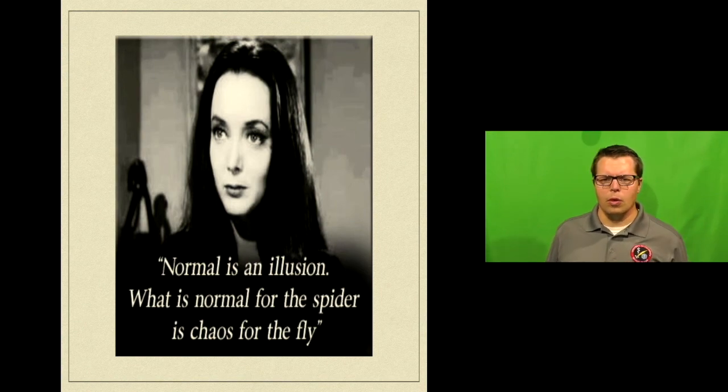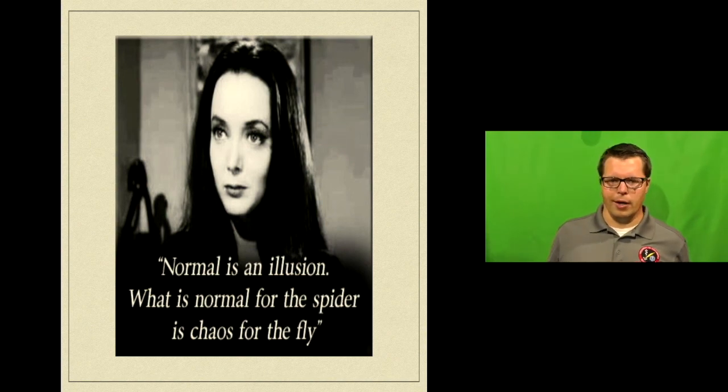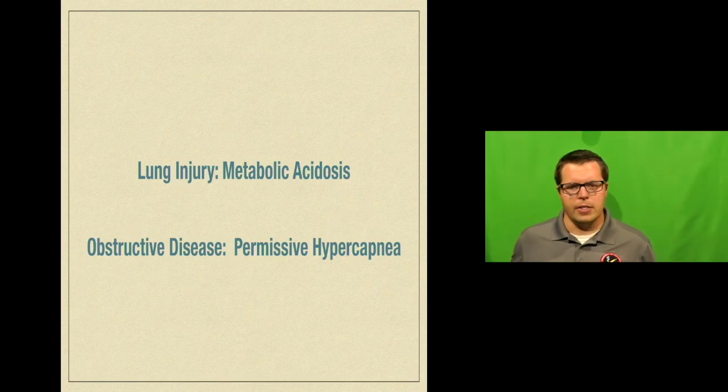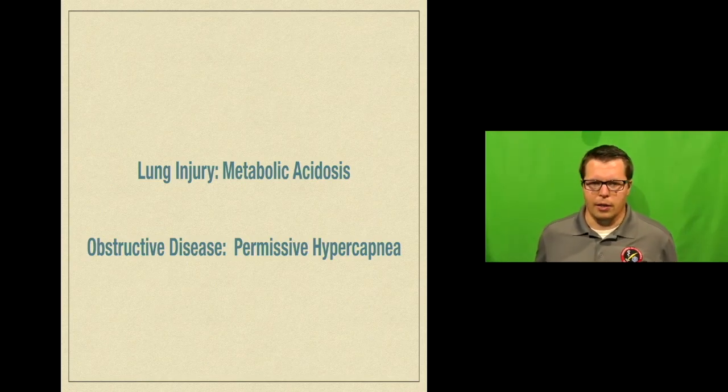Is this normal body reacting to something else? It may not be normal, in terms of what most of the population does, but is this normal for the person? Is this a normal response for the person due to whatever is going on in their body? Well, what the hell are you talking about? Look at the couple of times when it may be dangerous to try to fix an end-tidal CO2 measurement based on respiratory rate alone.